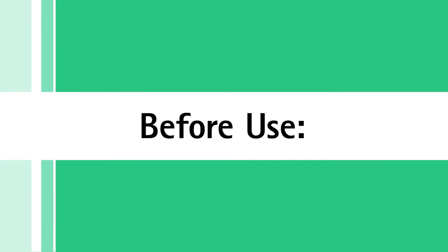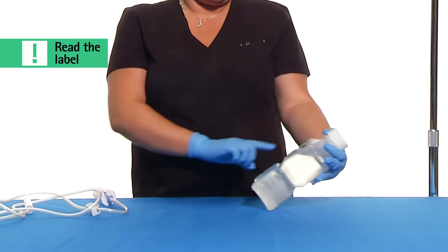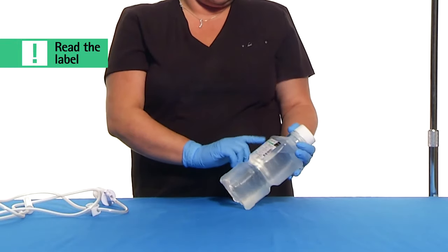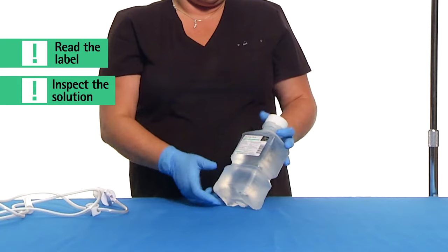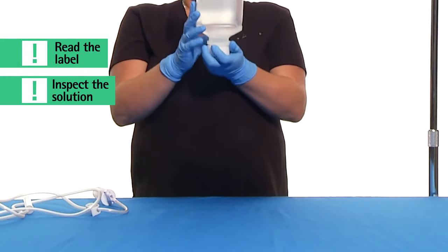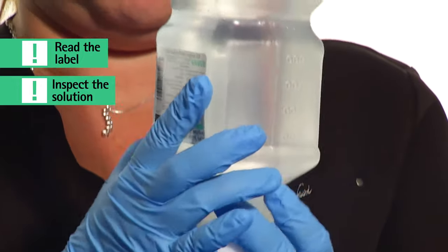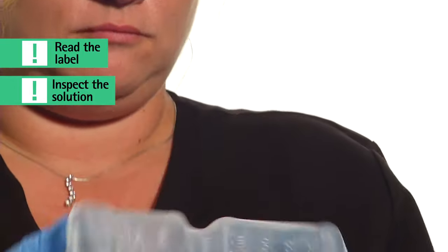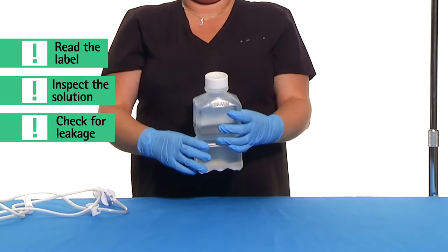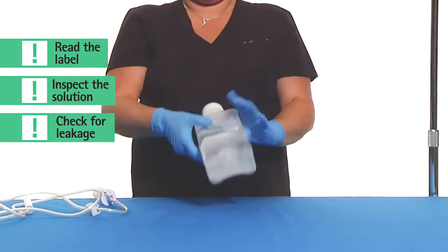Before use, perform the following checks. Read the label and ensure the solution is the one ordered and is within the expiration date. Invert the container and inspect the solution in good light for cloudiness, haze, or particulate matter. Use only if the solution is clear and the container and seal are intact. Check the container for leakage or damage. Any container which is suspect should not be used.